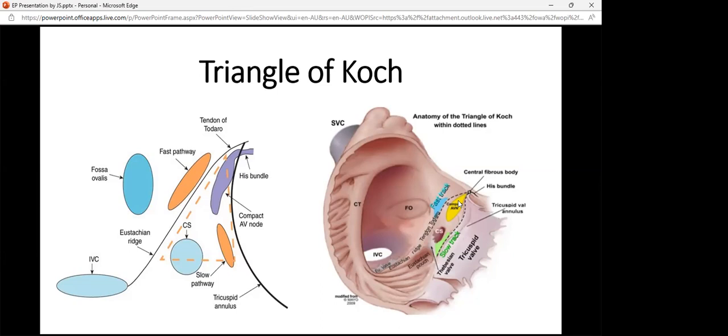If the patient does not have VA conduction at all, whether through a node or a pathway, then if you ever get a follow-up of your pacing patient and they've got runs of tachycardia, you probably know that the tachycardia is not an SVT, certainly not an AVRT, because they haven't got VA conduction. So it can help you diagnose your patients a little better, perhaps ruling in things like an atrial tachycardia more so than an SVT. It's quite a useful tool that I always use.